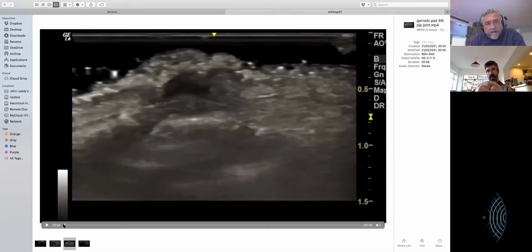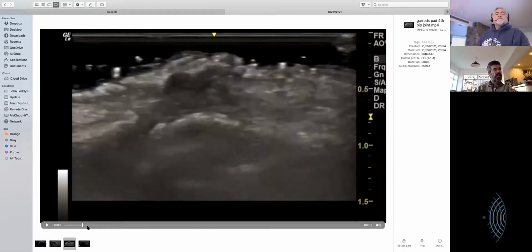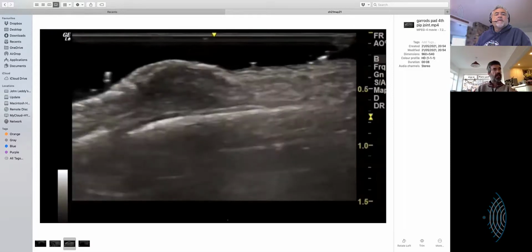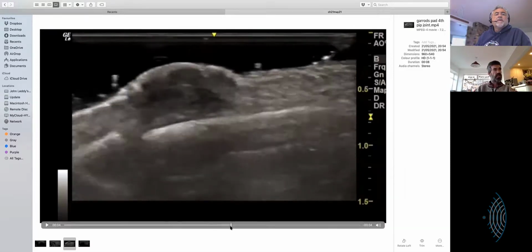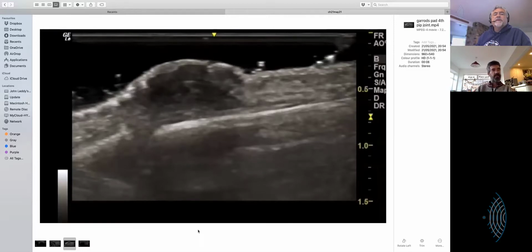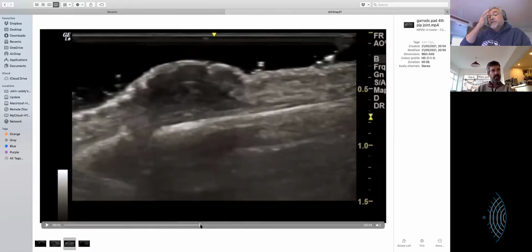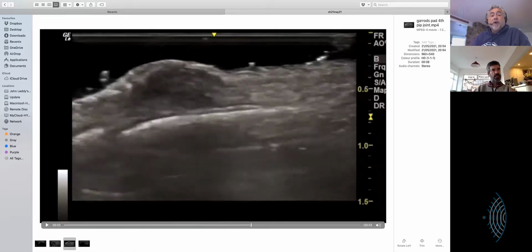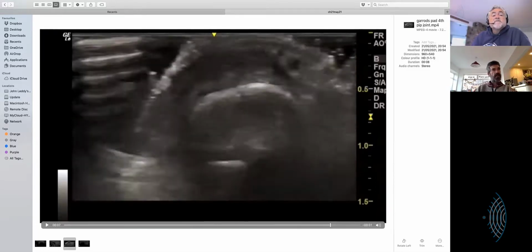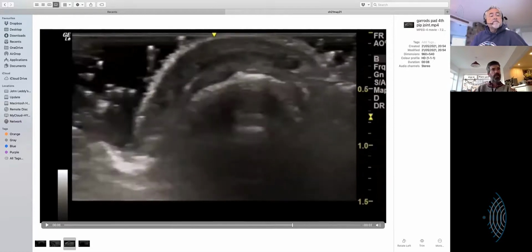Really? Yeah, you get little nodules there, and they're pretty uncommon. I don't think anyone's got particularly strong views as to what they are, but they turn up. They're hard to see unless you've got good quality kit. Just this thickening here. They are not tethered in any way to the extensor mechanism. But there's not much to it.